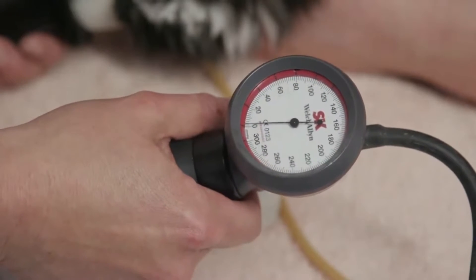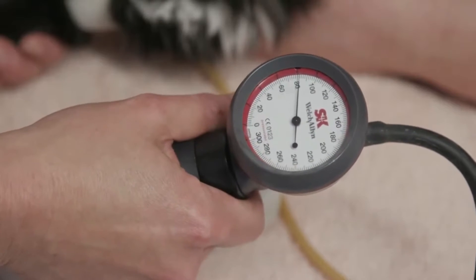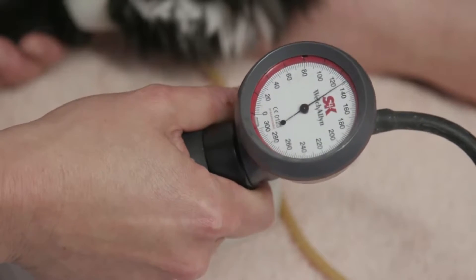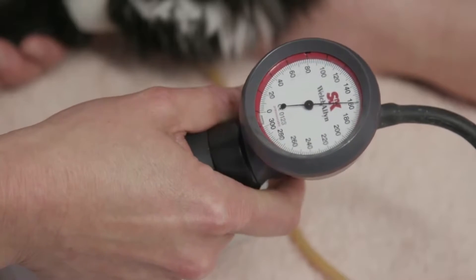Once we have a very good clear pulse signal we can inflate the cuff. I suggest that you do this nice and gently in a stepwise fashion, and all the time look at that pressure gauge, and look at the point at which you can no longer hear that pulse signal.